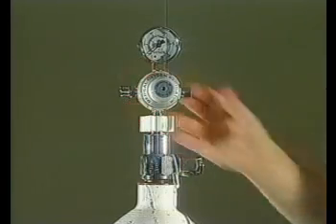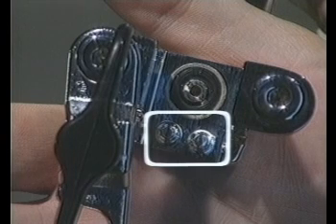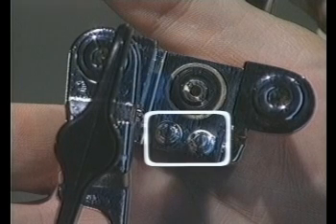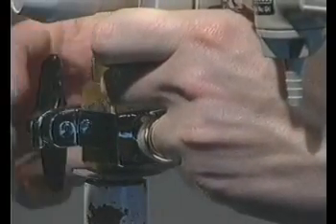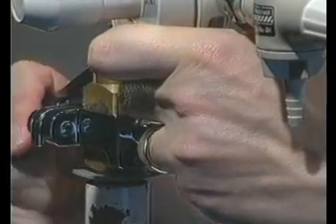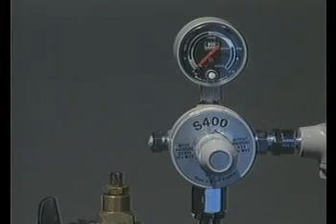You may find that instead of a bullnose valve, your oxygen cylinder has a pin index valve. The pin index oxygen valve has two holes, which correspond with two metal pins on the pin index regulator. They ensure that the regulator can only be attached to an oxygen cylinder, and therefore this system is safer. Where possible, cylinders with pin index valves should always be used. As with the bullnose valve, only a reasonable amount of force needs to be used to tighten the regulator to the cylinder valve.